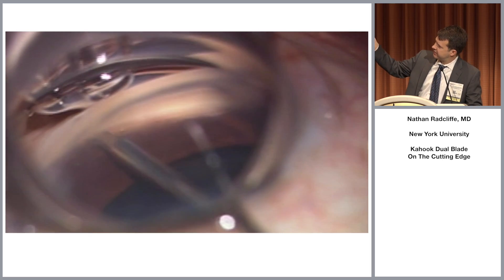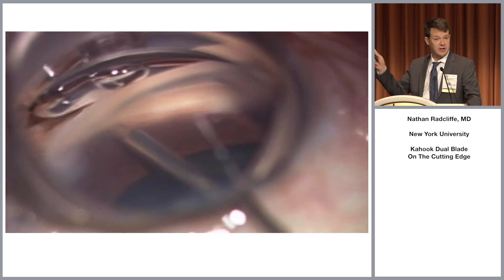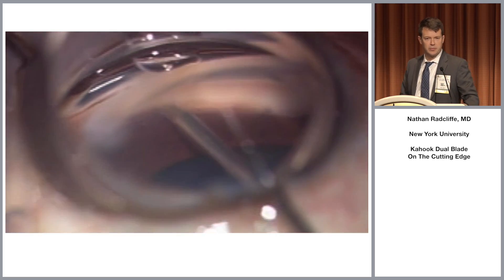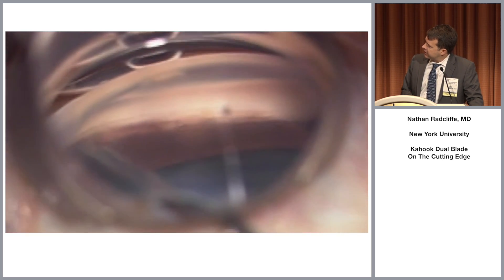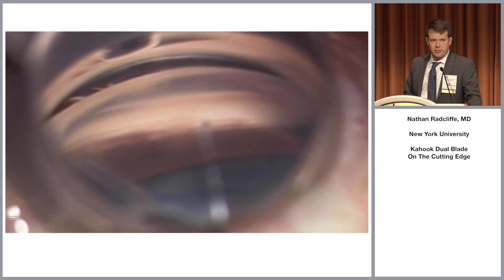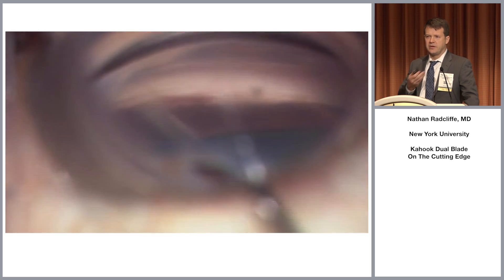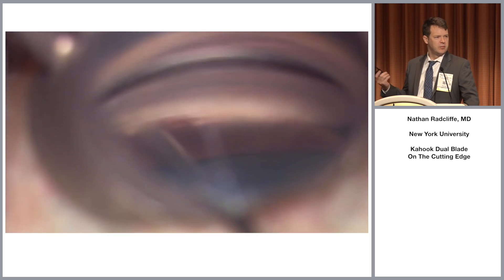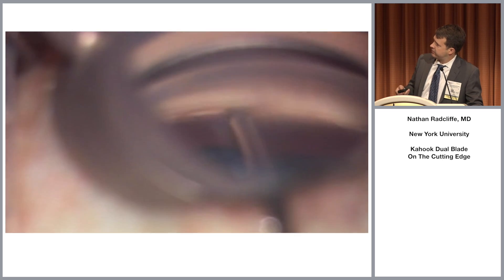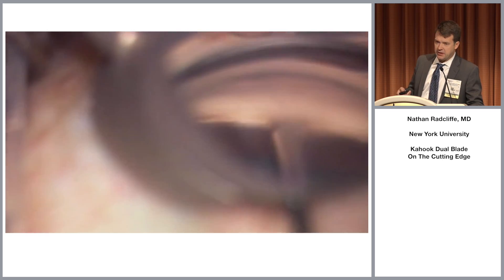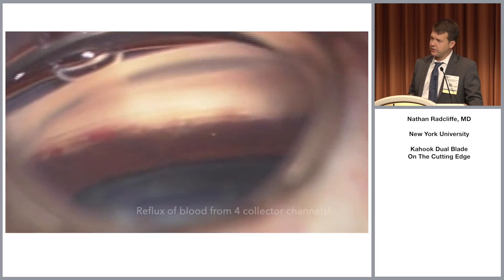You can see it's dangling as a little strip. We moved along and then we're coming back from the other angle. How many degrees can we open up? I think I was getting 110 to 120 degrees. You could technically come from a wound on the other side to get both the nasal and temporal angle.